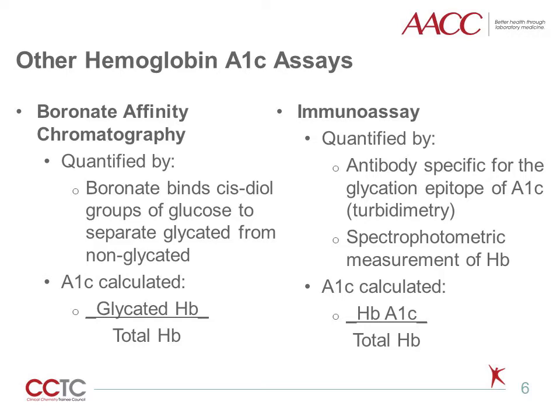Unlike the chromatographic and CE methods, these two methods, boronate affinity and immunoassays, do not detect hemoglobin variants that may be present within the sample, unless the point mutation is near the glycation site and thus changes the antibody's interaction, for example. Further studies are needed to ascertain if a bias exists within the quantification of hemoglobin A1c in the presence of hemoglobinopathies by boronate affinity.